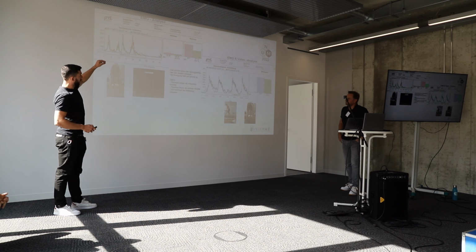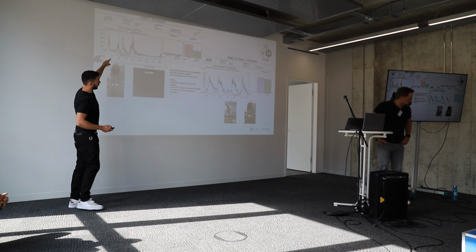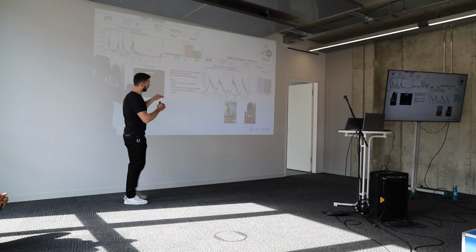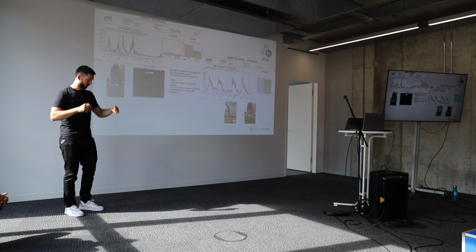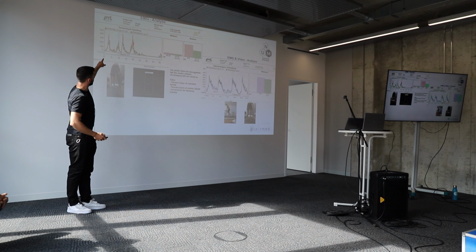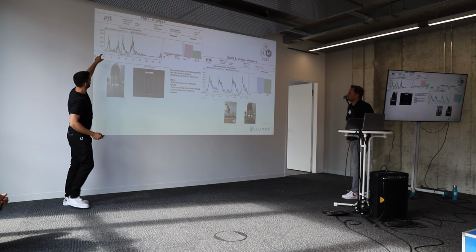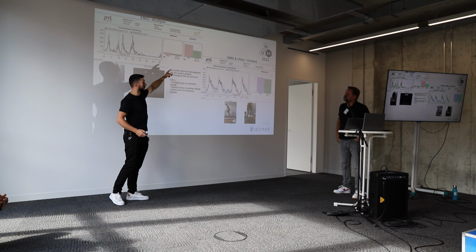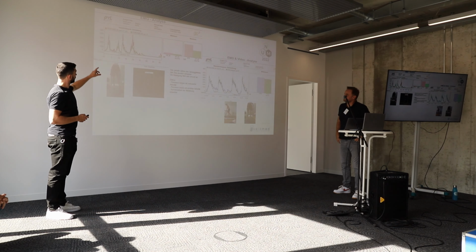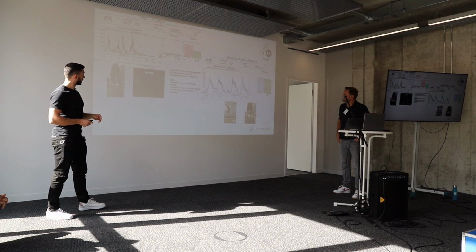And you see that the upper part, or the peroneus longus, is the green one in this case. And here also the green one. And the difference between these two parts of this muscle is that on the injured side, there's a big difference in maximum, but also in the mean, in this motion to get to a straight position again.